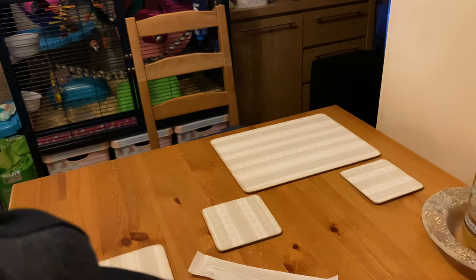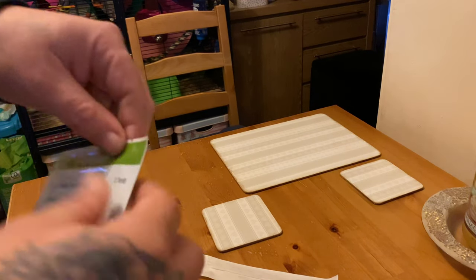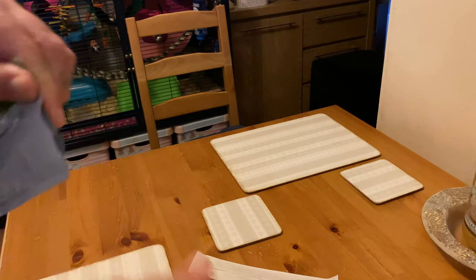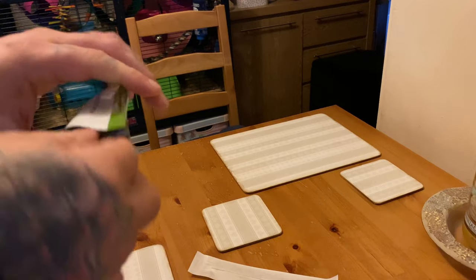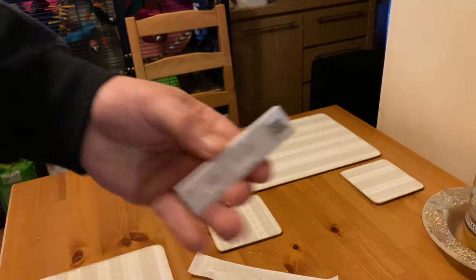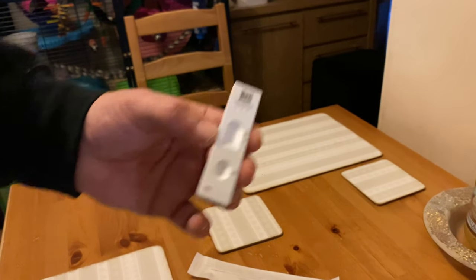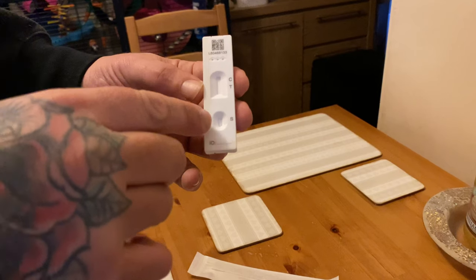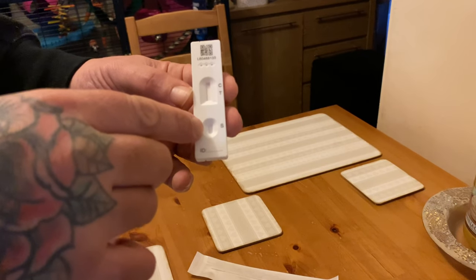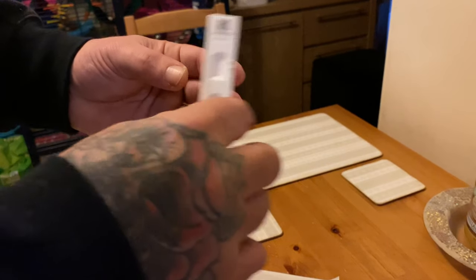Once you've done that, put the lid on and put it to one side — make sure it doesn't fall over and drip out. Next thing you want to do: get your test cartridge out. That's what it looks like. This is where you'll be dripping the fluid into, where it says 'S,' and that's where it gives you the result.